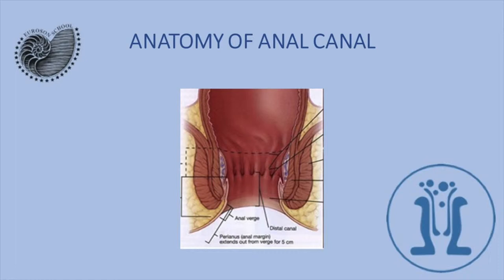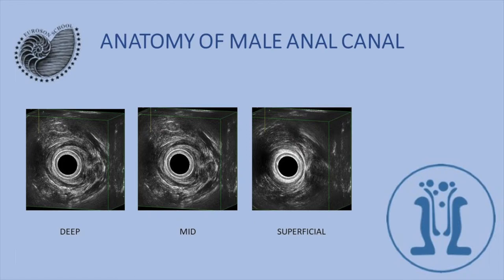I'd like to show you the anatomy of the anal canal on ultrasound. Here is the internal anal sphincter, here is the external anal sphincter, and here are the perineal muscles — in the deep, mid, and superficial positions.